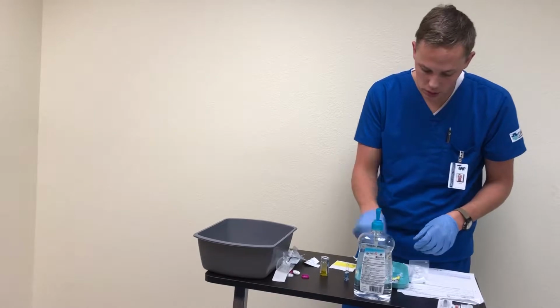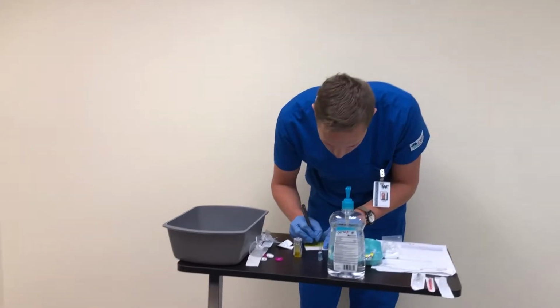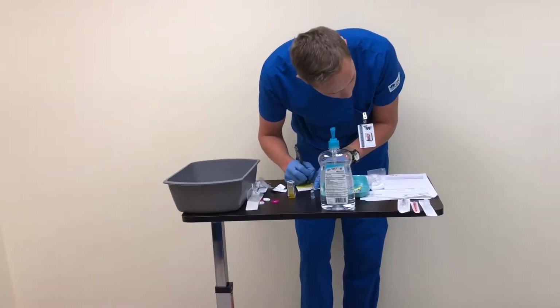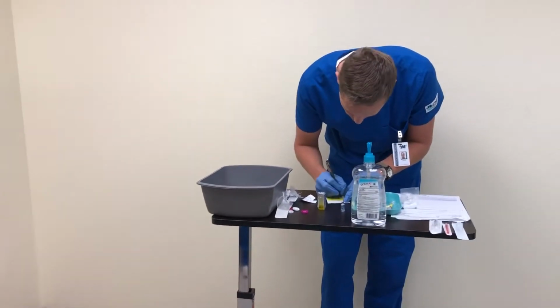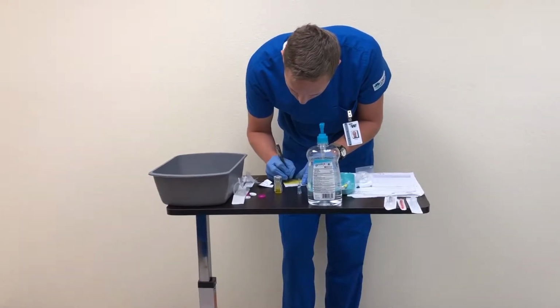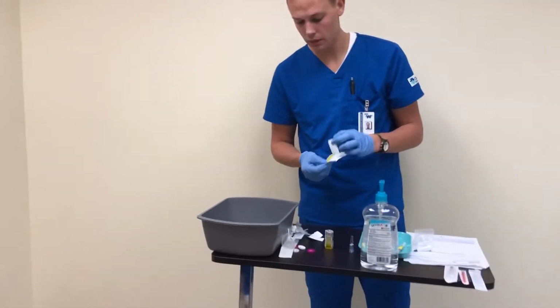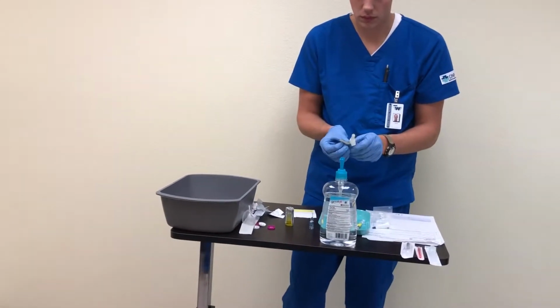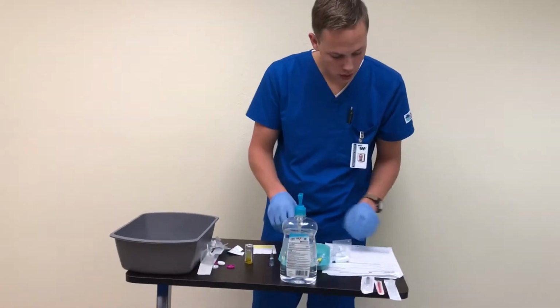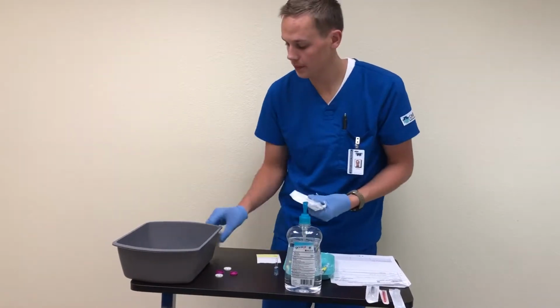And then we're going to label this one as well. So that's the ceftriaxone at 250 milligrams, and we got my initials and the date and time, 9:30 meds, and it is 10/4/19. And then we'll wrap that one up. Okay, and lastly we will be going on to the Phenergan again. Just gonna clean up my workspace a little bit.